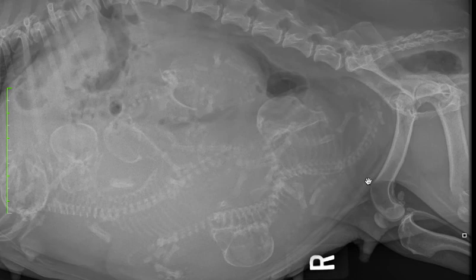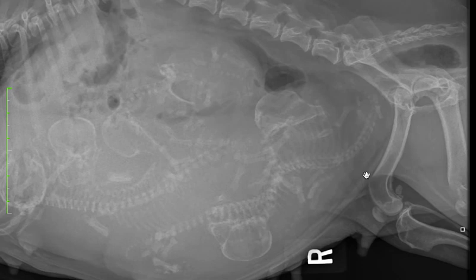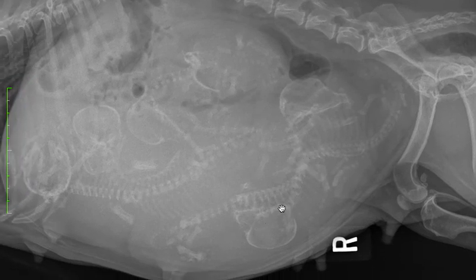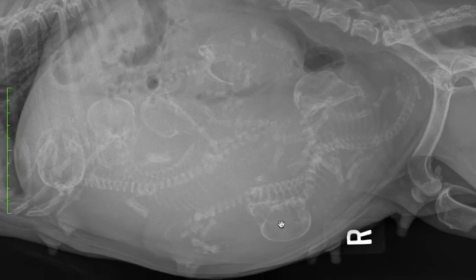All right, let's look a little closer. In this case, we know that labor delivery has been delayed and that there's many puppies left to be born. So this is a different scenario than last week, where we were simply wondering how many more are we waiting for. We want to look in a case like this at the positioning, as well as for any radiographic signs of fetal issues. That could include, for example, gas within the fetal vessels, gas within the fetal body cavities, so thorax or abdomen, separation of the skull bones.